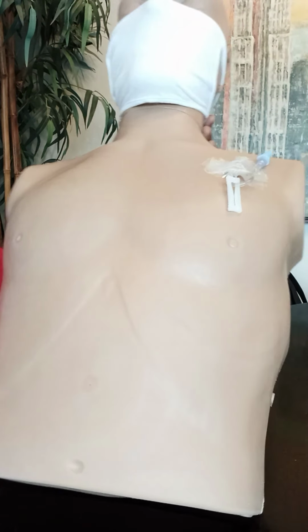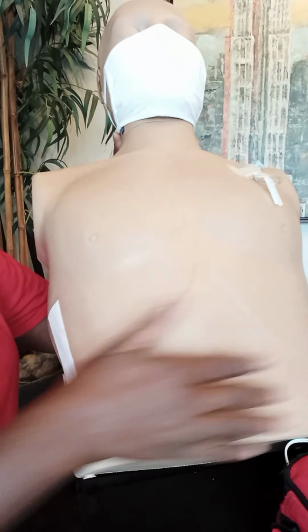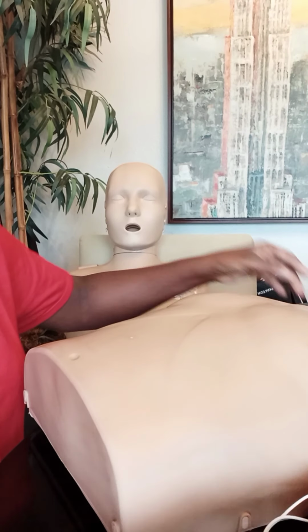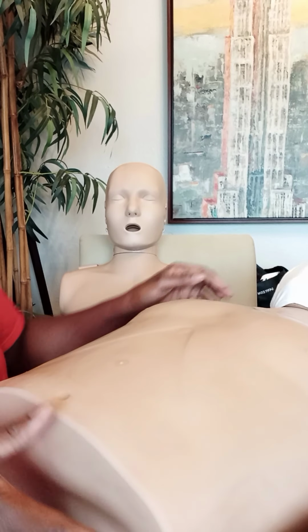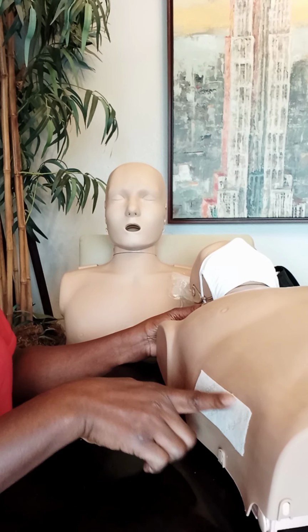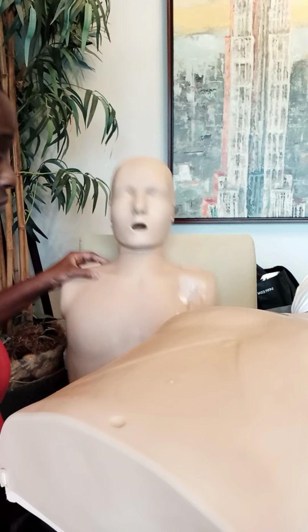Now, these are the areas where you'll put the AED pad on, which is what I'm talking about today. So, right side and left side, right? This is very important for you all to know. You don't want to place an AED pad on top of a port area. You see that? Again, you don't want to place it on top of a medicine patch, and definitely not on top of a dialysis catheter port, right?